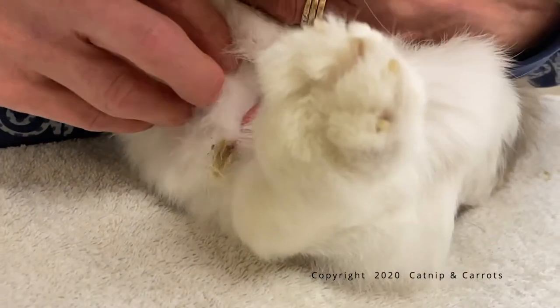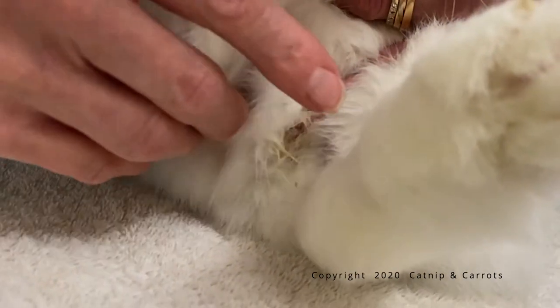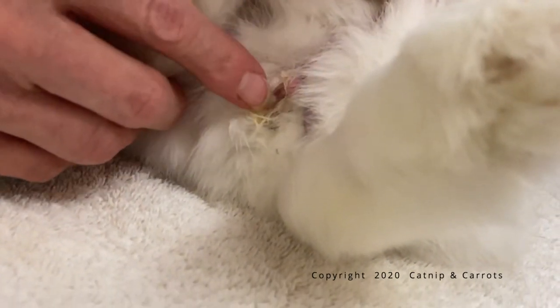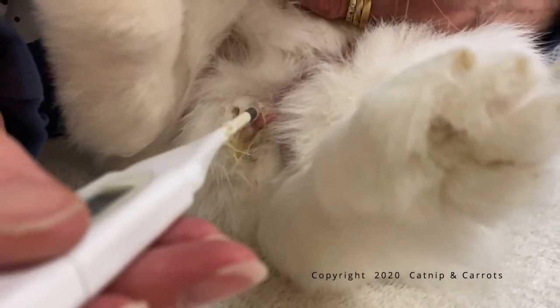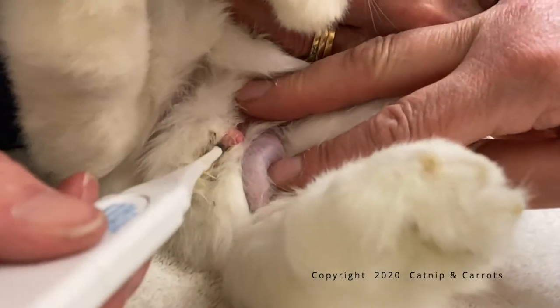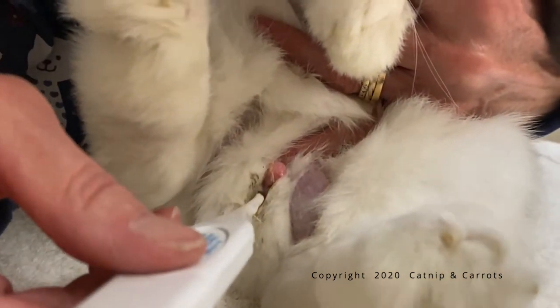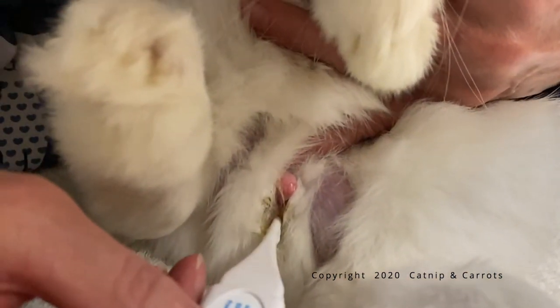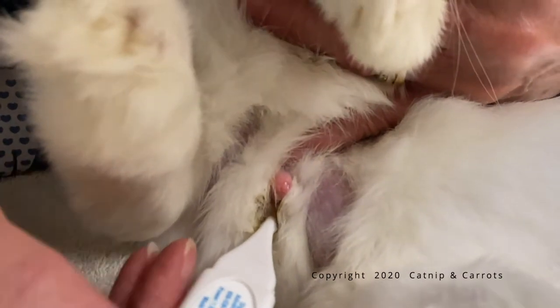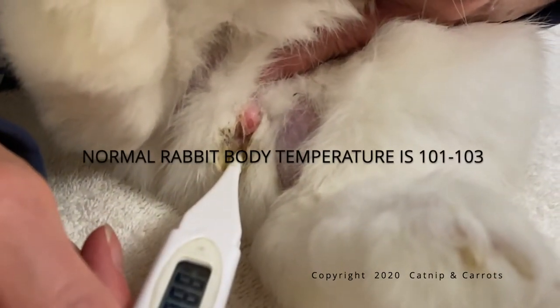That's not going to be his rectum. His rectum is down here — it's surrounded by fur, right there, and it's a little bit of a line. So after the thermometer is well lubed, you can just gently insert it into this hole, gently insert the thermometer and then turn it on. And that's how you can do it.